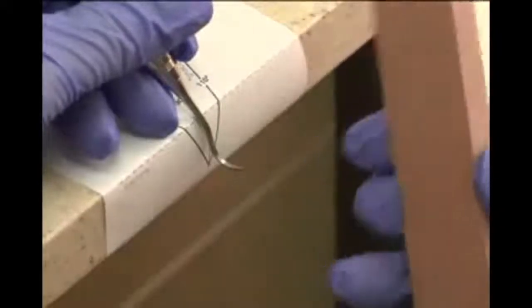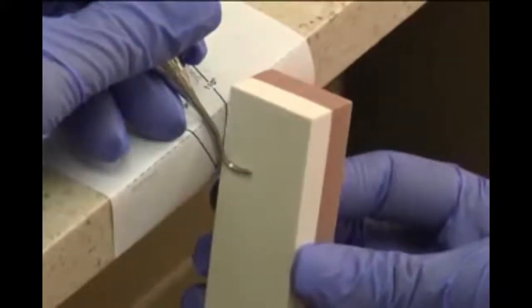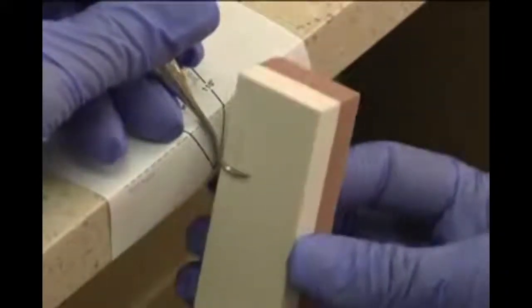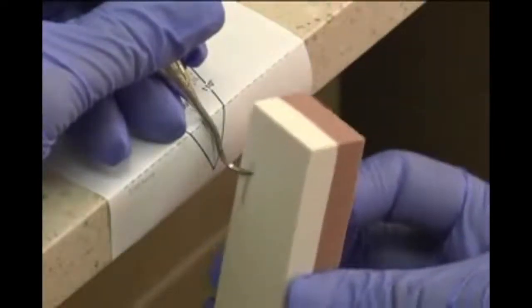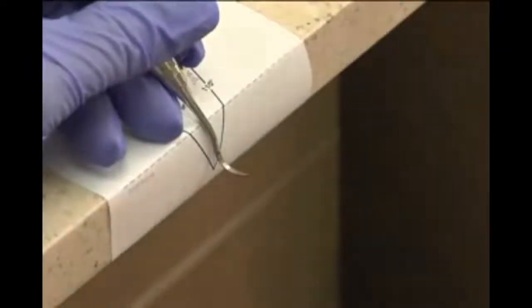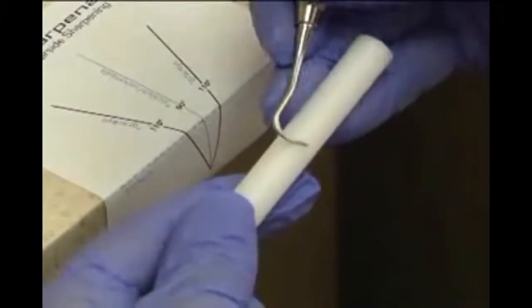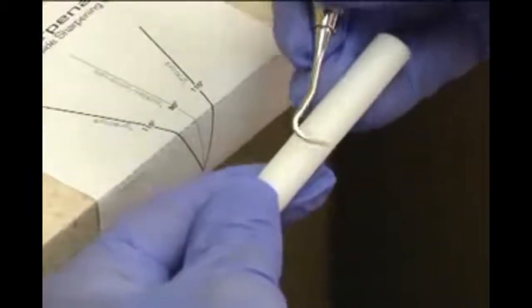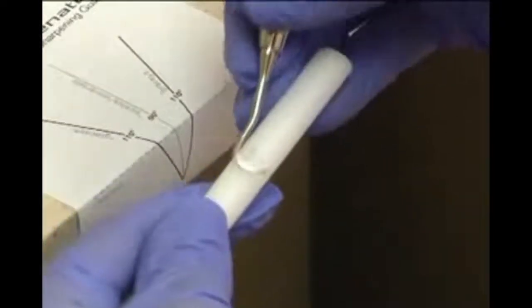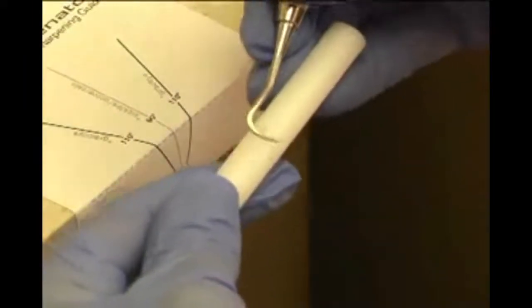Now, because this is a coarse stone, I'm going to turn the stone, and again, I'm going to finish now with the fine medium side. If you're just maintaining your instrument, you don't need to do the coarse side. And that's that. I'm going to test for sharpness. I test the back, the middle, and the toe. So that grabs on very nicely. If it was sliding like this, then you know it's dull. But if this back part here was sliding, I would redo the entire blade. I wouldn't just sharpen the back, you have to redo the entire thing.